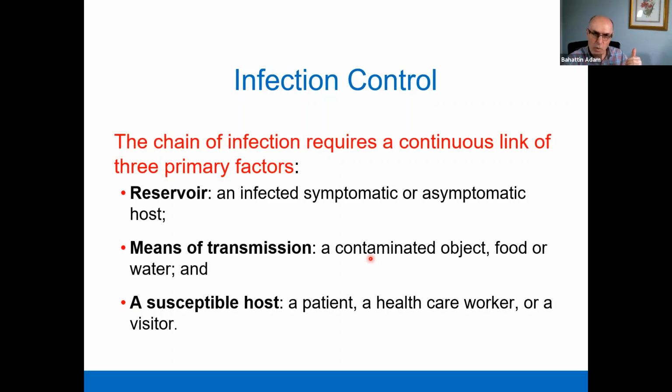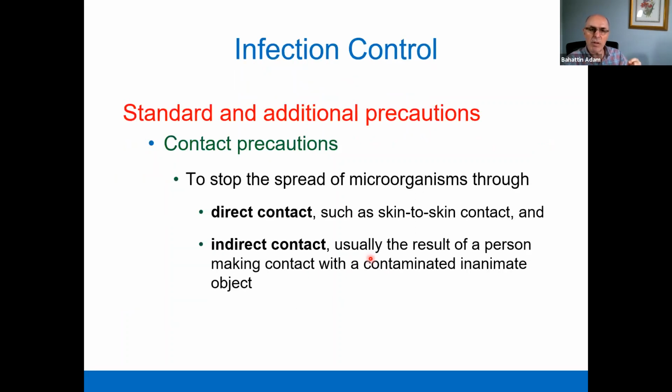Therefore, we need to take precautions to prevent infection due to blood collection.